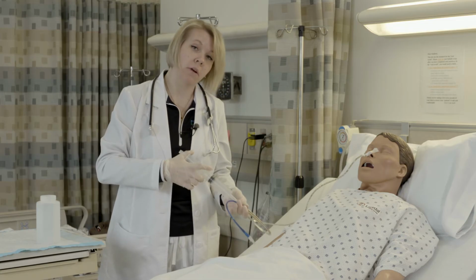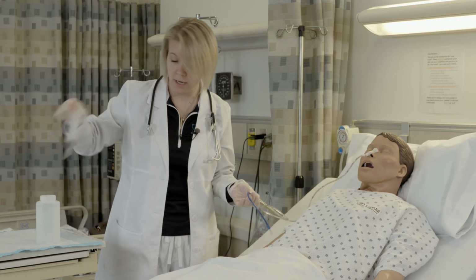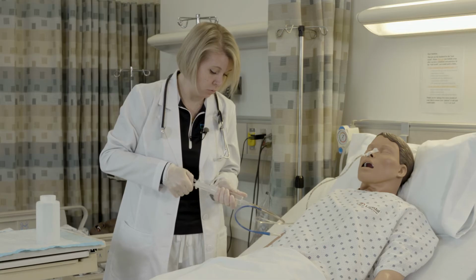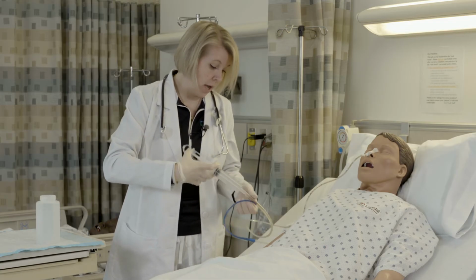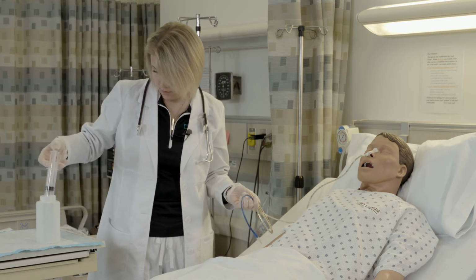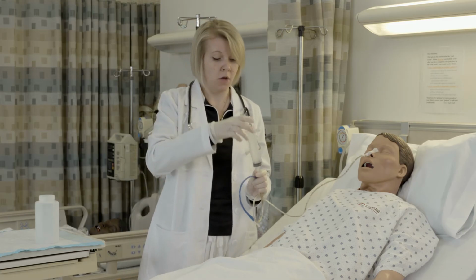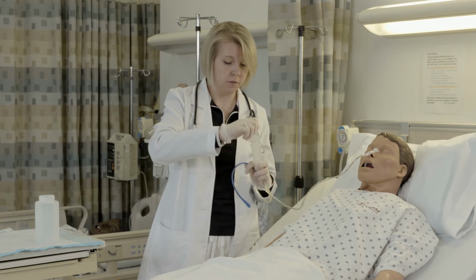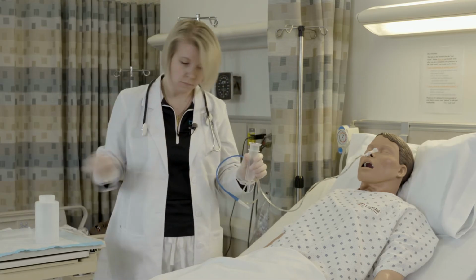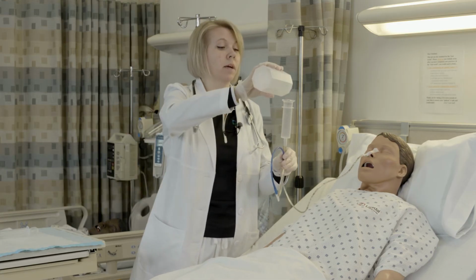It's important that you check with your hospital's policy as to what they consider excessive. And if it's excessive, we're going to want to hold the medication as well as hold the gastric residual volume and contact the physician. So our patient just had his gastric residual volume, and it's not considered excessive based on our hospital policy. So what I'm going to do is return that to our patient by taking the plunger out of our tube. And I'll give that right back to my patient.